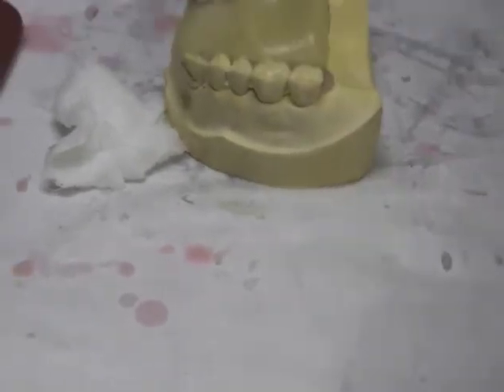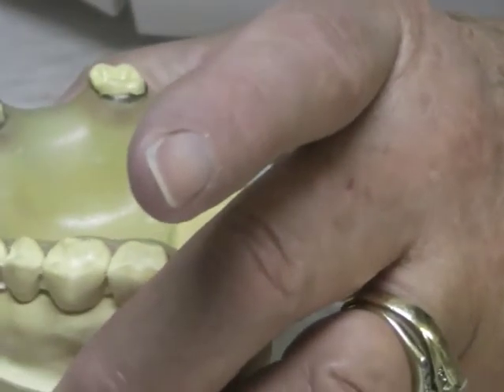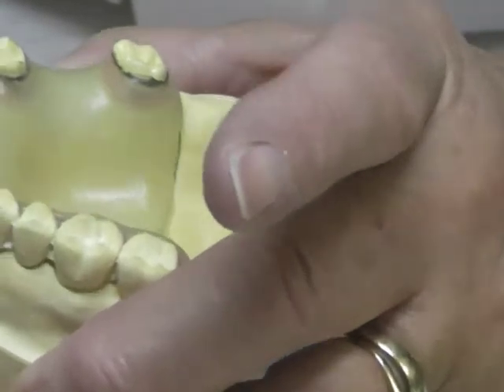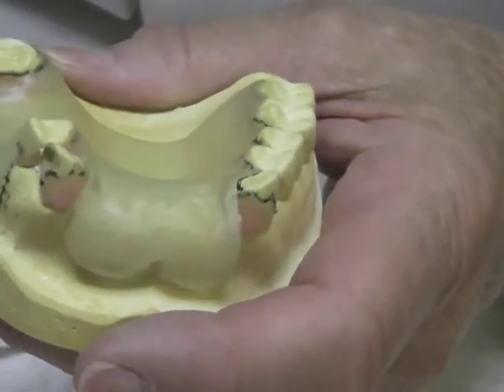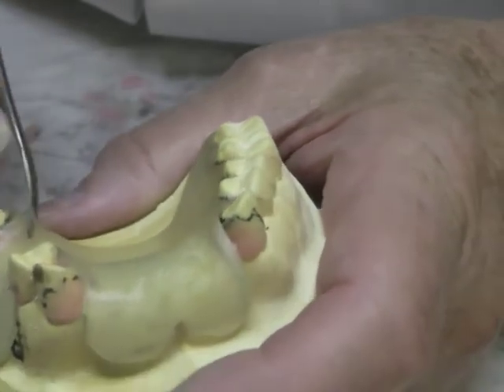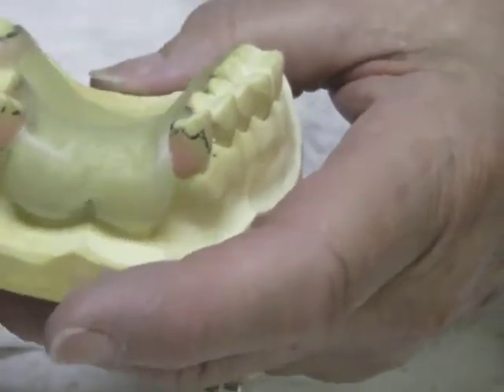Before you cure the triad, make sure you put some retentive areas into it by placing some dents in it — those are going to help with retention of the wax to the triad rim. That's one of its negative features: it's hard to get wax to stick on this rim real well. Do that in the other edentulous area too. I like to put some retention on the buccal and then on the lingual so it's kind of locked on from both sides, plus some other indentations in that area. Then we're ready to cure for 20 seconds.